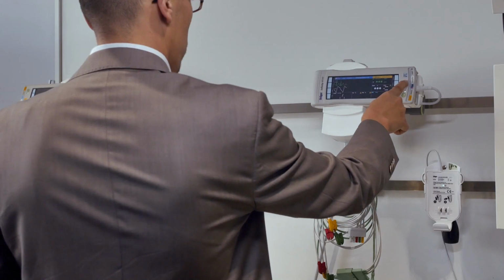When the patient becomes more critical, then we need to have more advanced measurements, such as invasive blood pressure. And the invasive blood pressure gives us information on if the patient is hypotensive, so a low blood pressure, or hypertensive, a higher blood pressure.